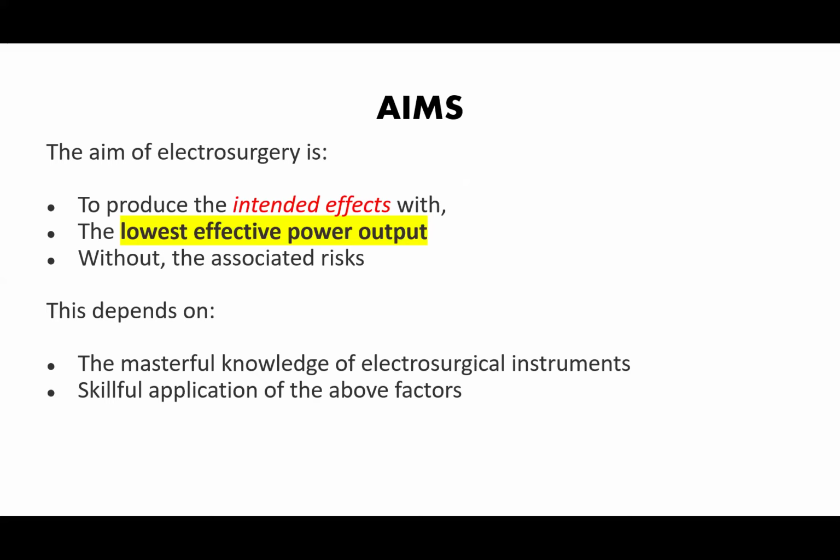If you are to take any information out of this lecture today, the most important thing you should go with from this lecture is you should produce an intended effect with the lowest effective power output from your energy source. Because with the lower output, you have least chance of developing complication.